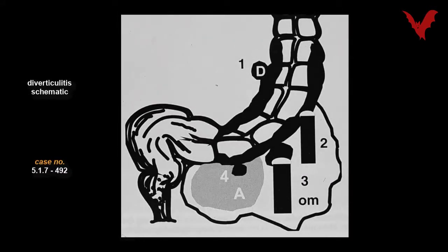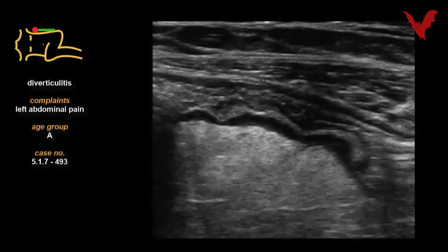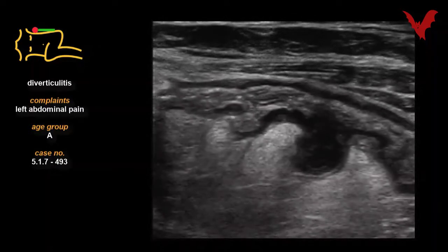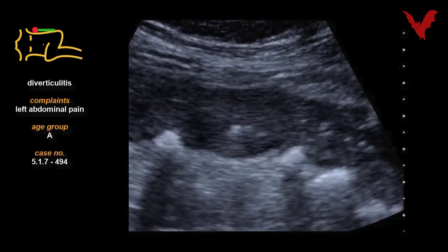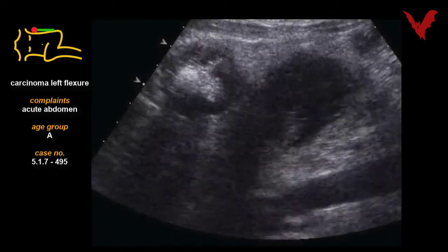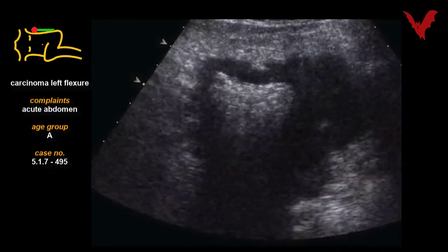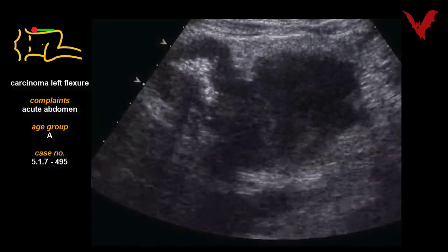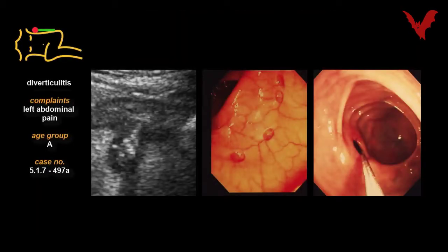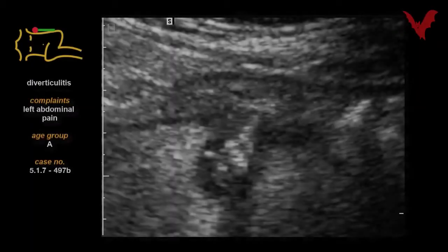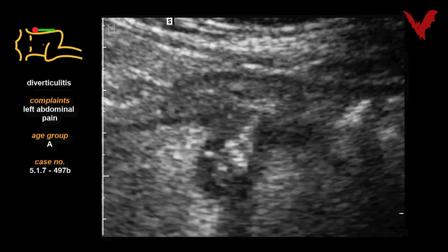Case 491 is another example of the importance of careful differential diagnosis. Case 492 shows a schematic drawing on diverticulitis. In case 493, returning to diverticulitis with wall thickening and shadowing, which is seen in 494 as well. Case 495 shows a carcinoma of the left flexure invasive to the spleen. Case 496 shows diverticulosis by endoscopic aspect, shown again in 497a and in more detail in 497b. Note the small abscess formation.